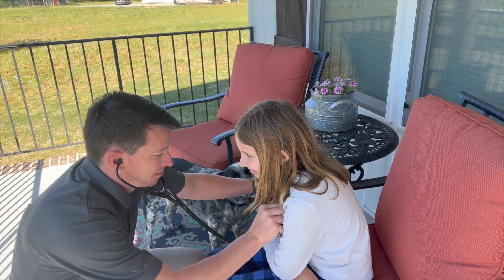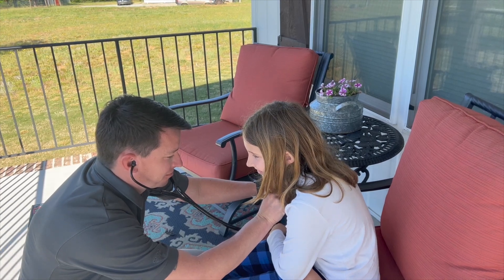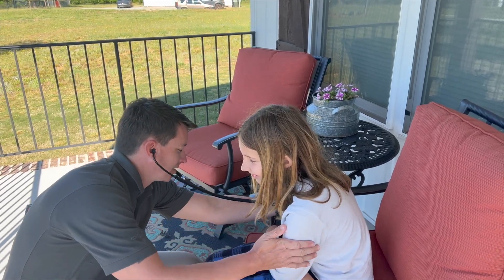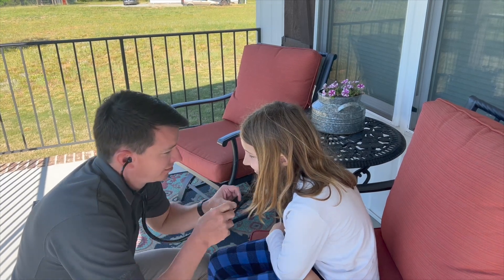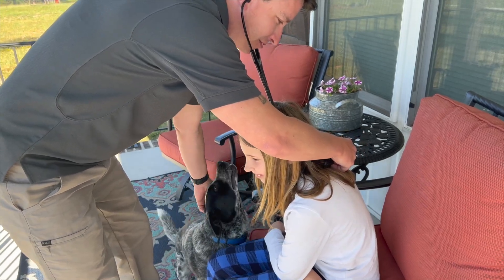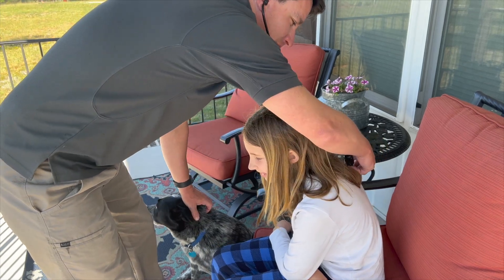Take a deep breath. [Demonstration of listening with the stethoscope.] Awesome.